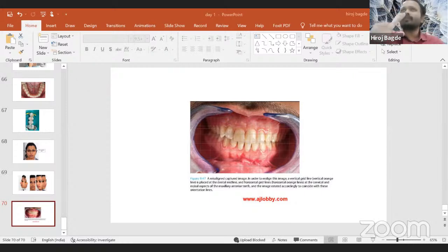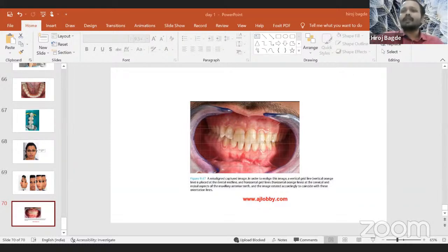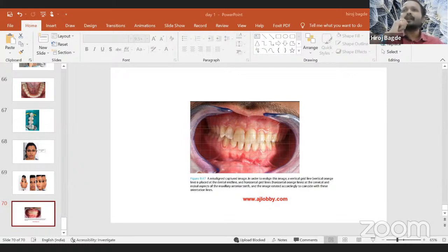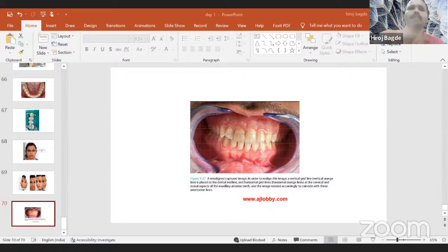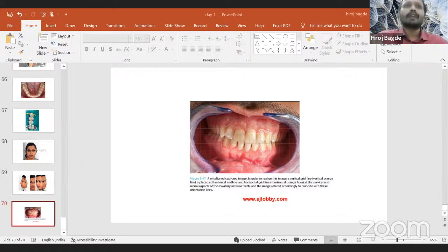All these are inside Photoshop. I'm not teaching Photoshop today, but the neutral color picker — neutral for dentistry is something called gray. We have gray cards associated. We place the card inside the oral cavity and take the photo. Gray is the new white. We'll have something called a gray card here, positioned just beside the area that has to be clicked. We'll pick the color neutral gray or white — it allows you to pick a neutral gray or white part of the photo to remove color cast. This is all yellow — just see what changes are happening. I've taken the dropper and picked this white line. Can you see it is more of white? I'll just go and click there.